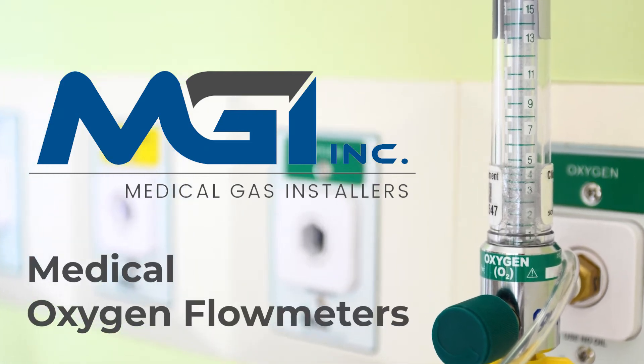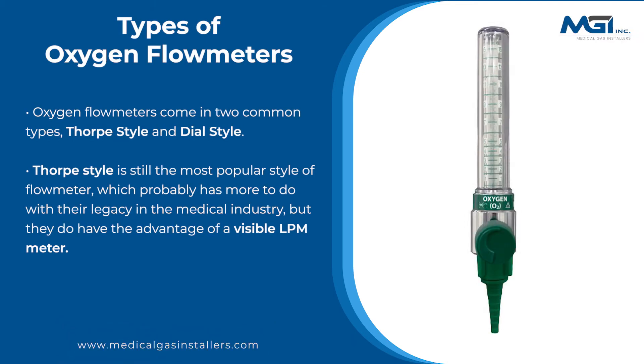MGI Medical Gas Installers provides various types of medical oxygen flow meters. Oxygen flow meters come in two common types: Thorpe style and Dial style.